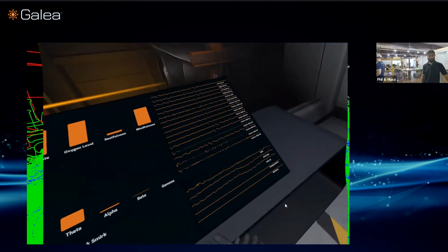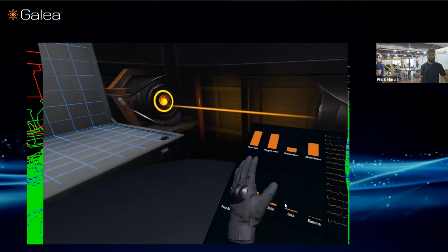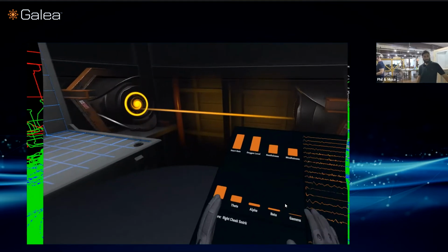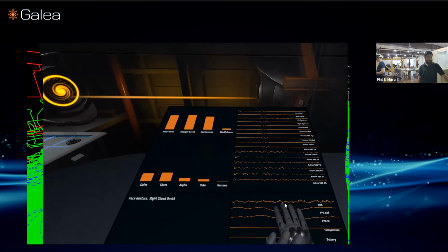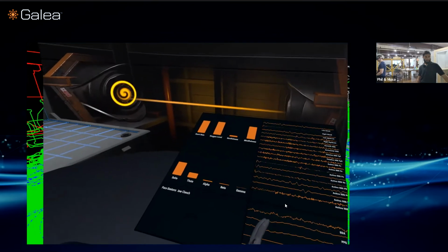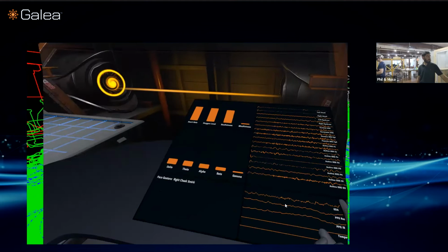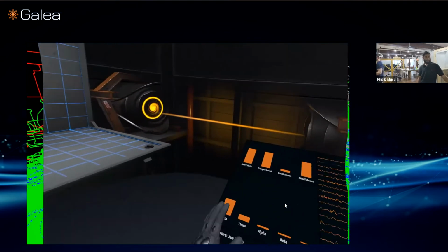It's interesting how these raw metrics can be used to figure out this kind of higher level information. And that's really where we're focusing our efforts now. We've got a lot of this raw data point type of information, these time series graphs. And now we're starting to look at how we use all of this information and fuse it together in order to get these first derivative metrics.